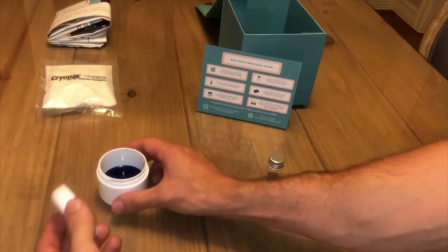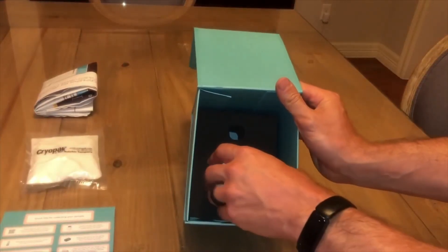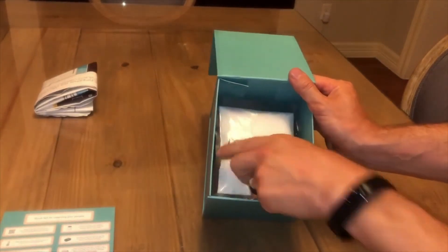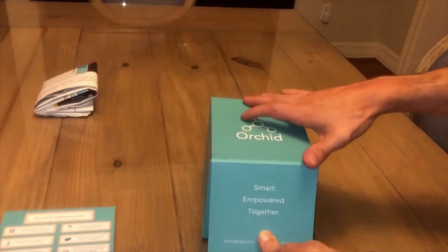Screw the lid back onto the cup and insert the cup into the foam insert. Take the temperature control pack and lay it on top of the cup. This will help maintain a constant temperature during the trip to our lab. Close the lid of the package and slide the box into the shipping bag.